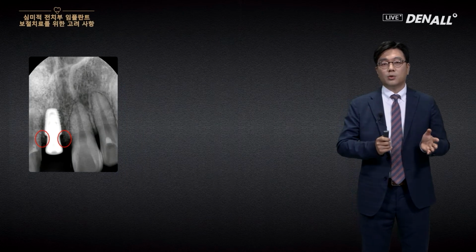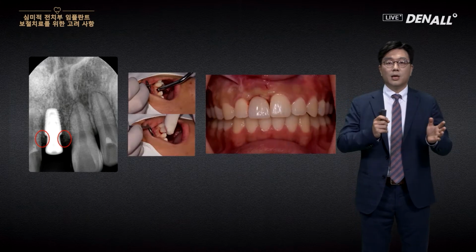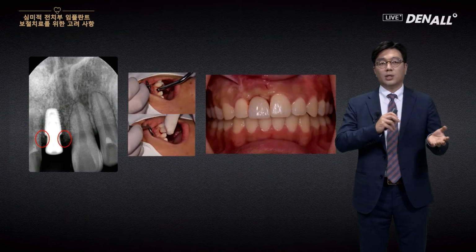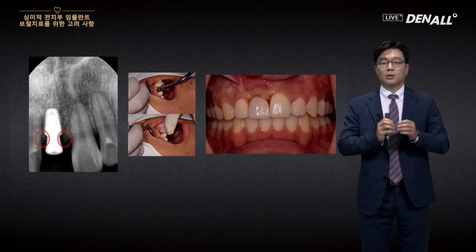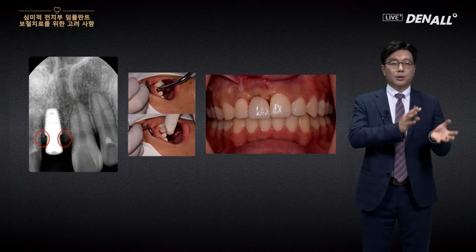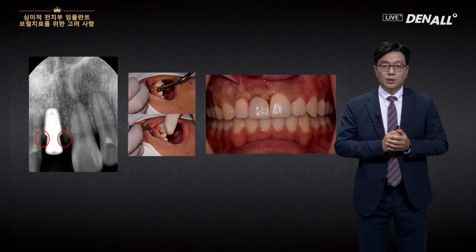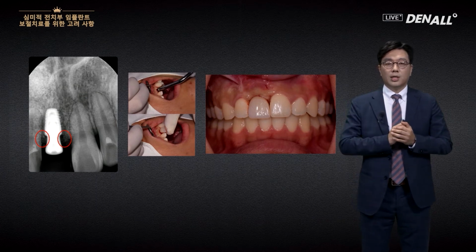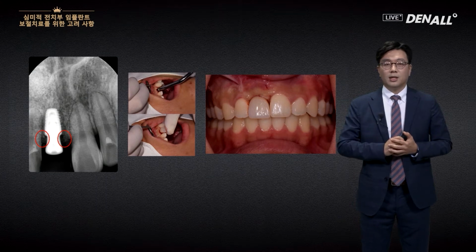Healing can be done very well. When the temporary is made, the provisional cannot fit in, as the gingiva is solidly made, so they cannot be fit in, and you need to make the adjustment. For the provisional fabrication, you need to communicate with a lab technician, and screw retain type is good, and we need to be careful in creating the platform portion.